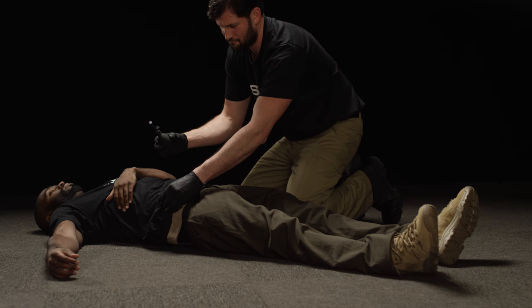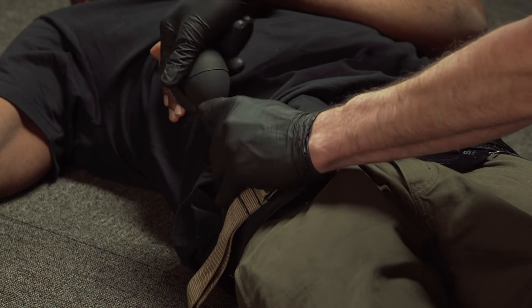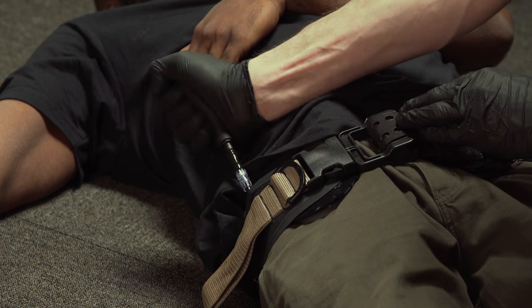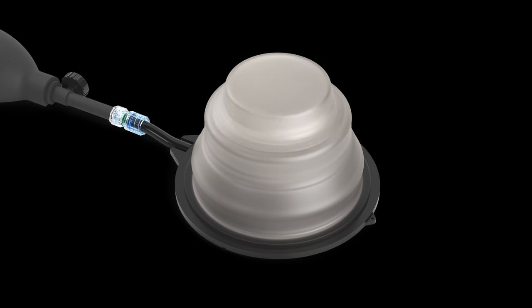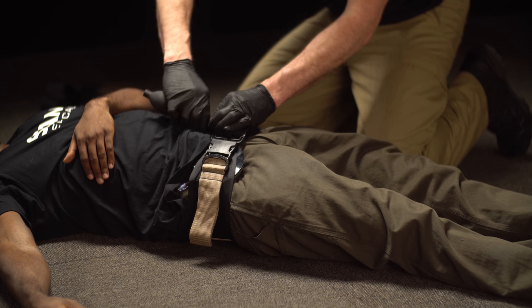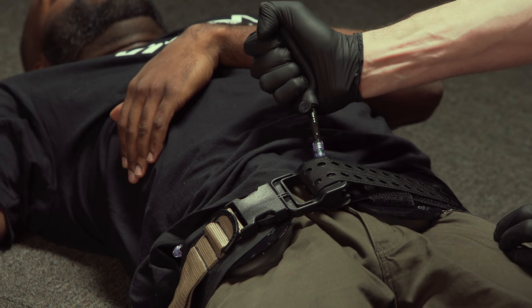Use the hand pump or any luer lock syringe to quickly inflate the TCD until hemorrhage is controlled. Utilize both TCDs to occlude blood flow bilaterally.